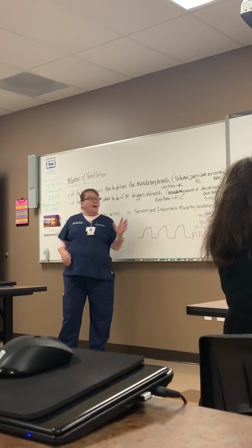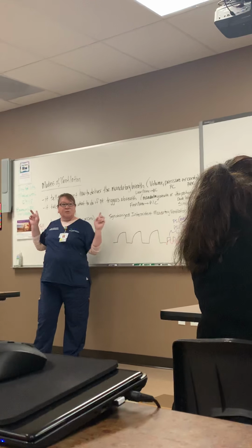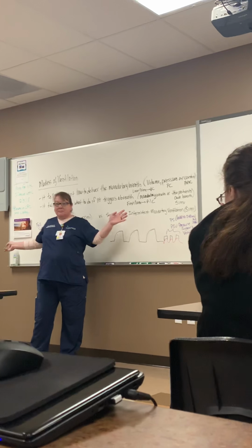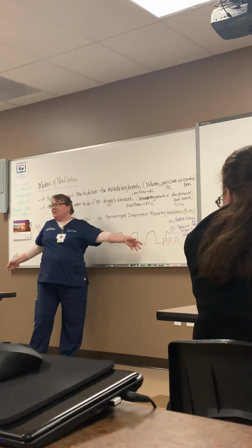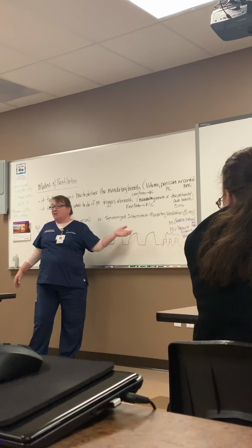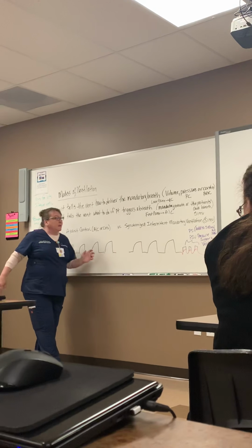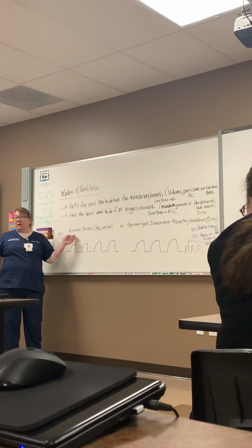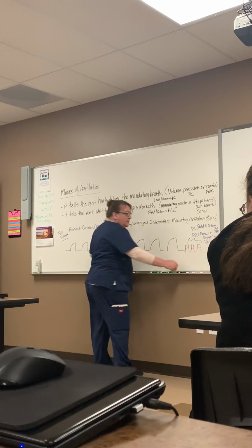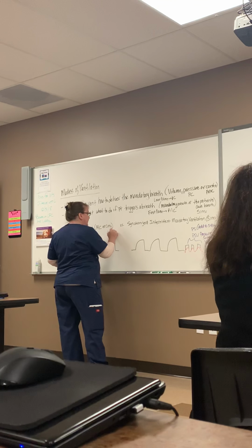Okay. As we get through this, this is one of the ways I have said you could tell what mode you're in, by what you can set. If I see a pressure support option available, I have to be in SIMV something, or just plain pressure support by itself, which is what we do to wean. If I'm in assist control, pressure support is not there. That's the other big thing you need to understand: there is no PSV in AC.